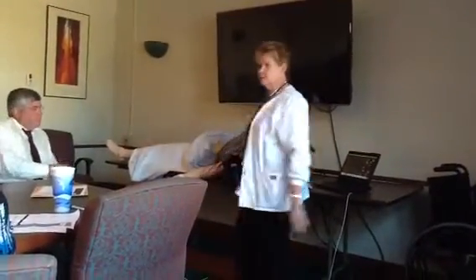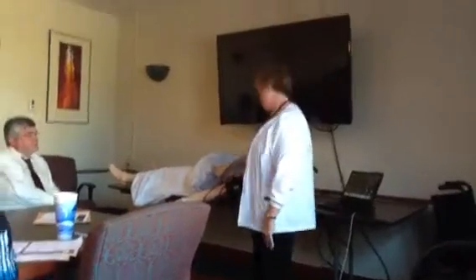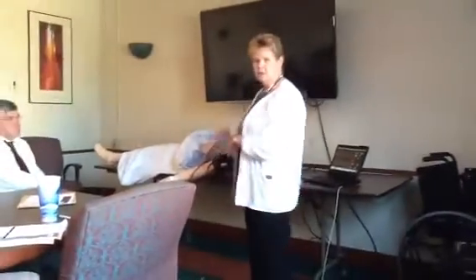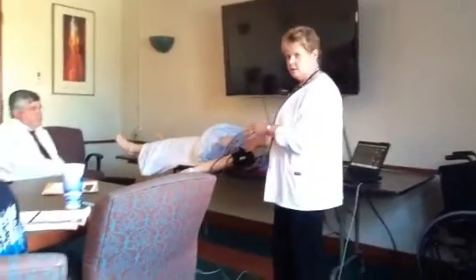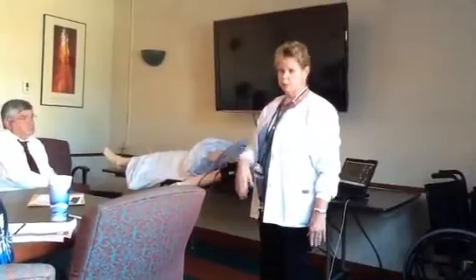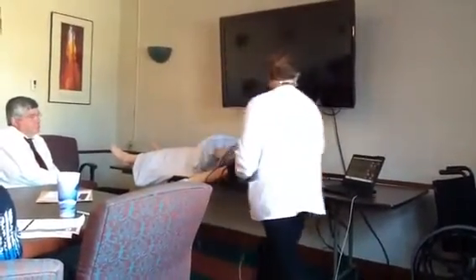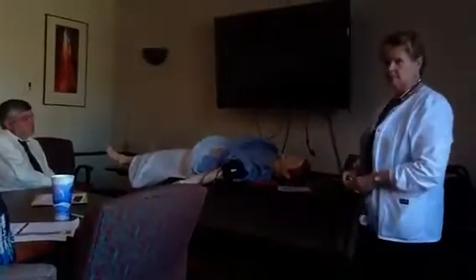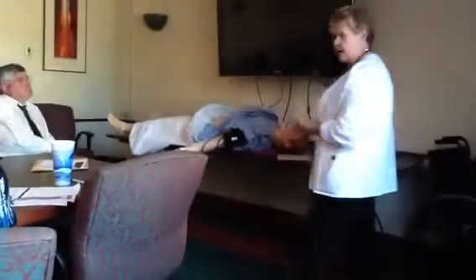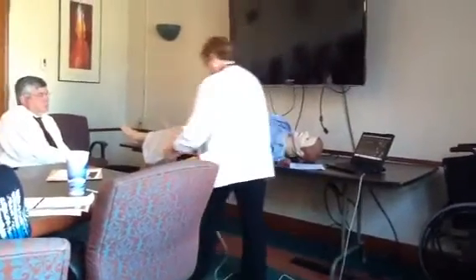Blood pressure, he has a blood pressure, so you can take his blood pressure, you can change his blood pressure. So say you want to change his blood pressure and you want the student to figure that out by themselves, you can change it. They have to take his blood pressure and tell you what it is. He has a pulse ox on that, if you take it off, it goes off the monitor. So it actually has to be on him to work.